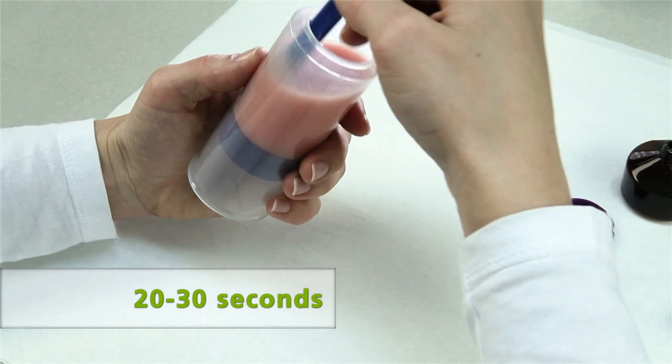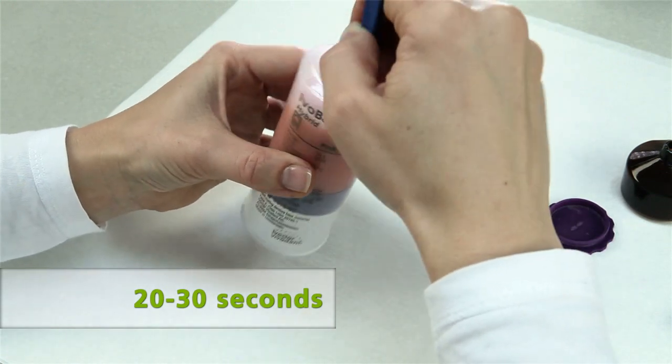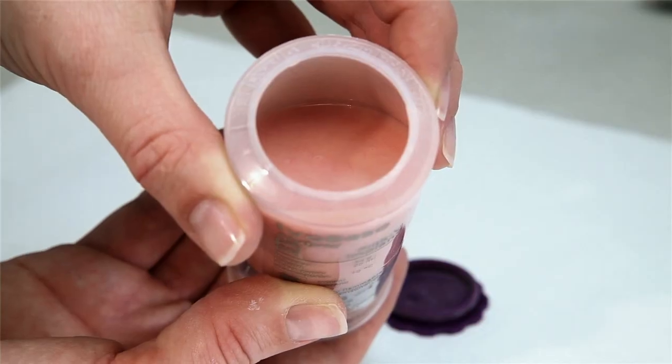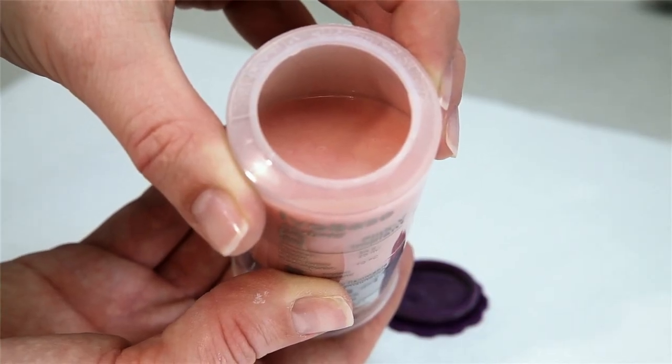Use the spatula to mix the monomer and polymer to a homogeneous mixture for approximately 20 to 30 seconds. Make sure that the material is thoroughly mixed.